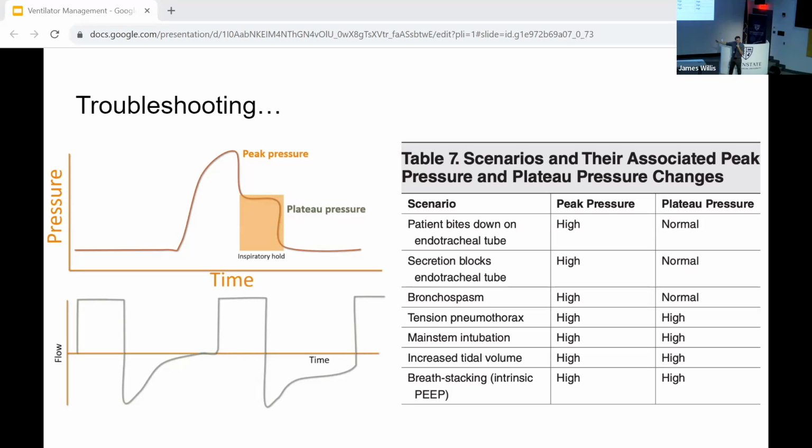The ventilator can be used as a monitor too. Not only is it a supportive device, but it can be used to help you monitor the patient. So this is what often happens. If you use sux, you have about 8 minutes before things start to get really interesting, depending on why you intubated the patient. If you used rocuronium, you have about 40 minutes. Both patients are getting appropriate sedation. But what happens after the paralytic wears off?